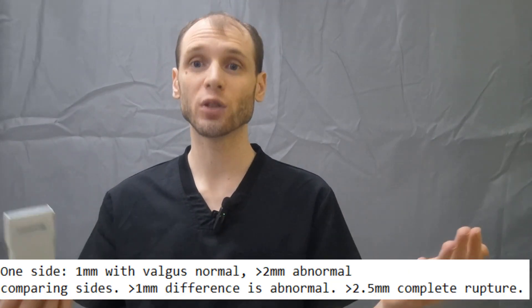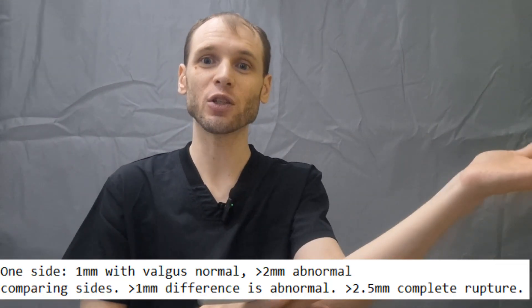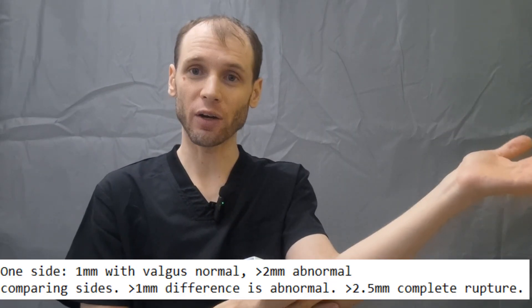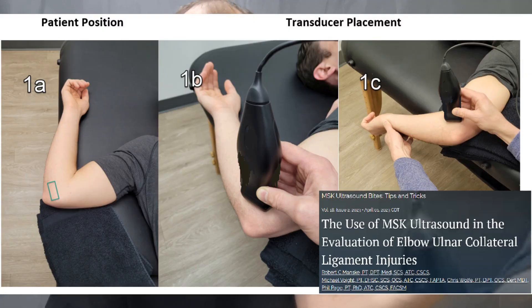There are different ways to do the stress test. If you're very dexterous maybe you can do the stress test as you hold the transducer. You can have an assistant help pull the arm as you're scanning, or you can have gravity do it. The research suggests that just the weight of the arm is sufficient to see enough opening to make your clinical decisions.